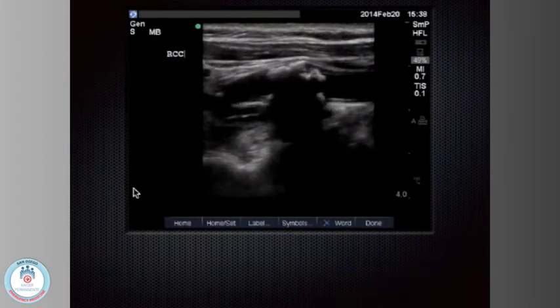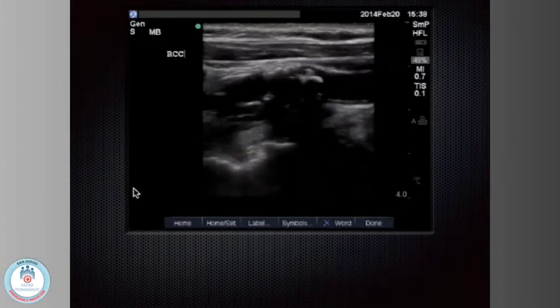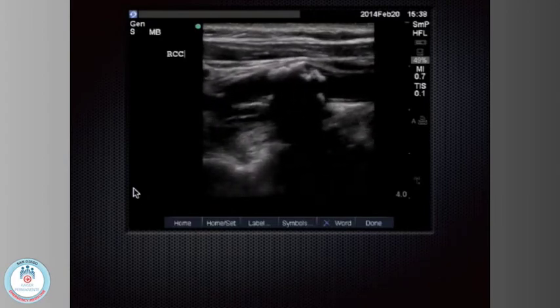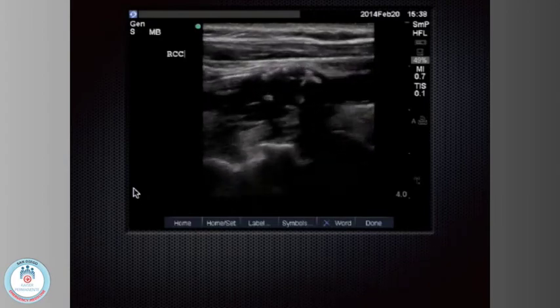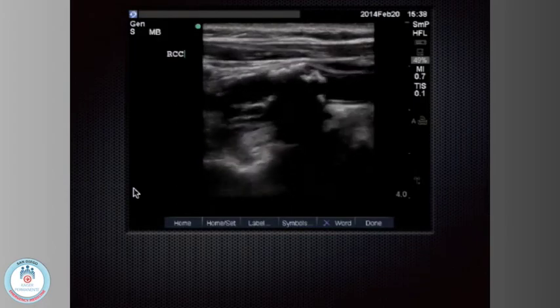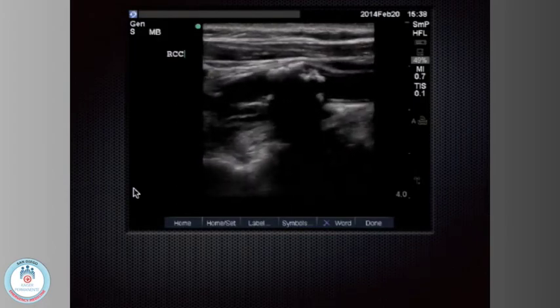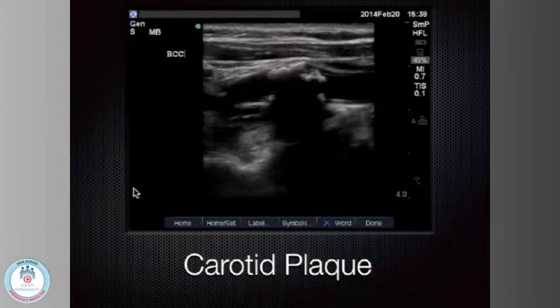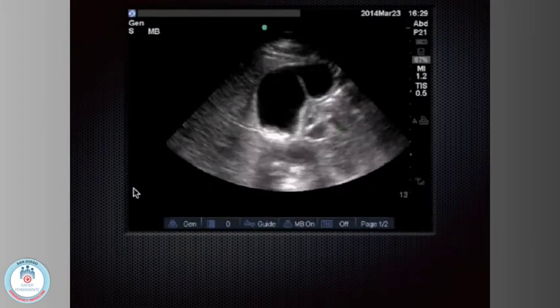Sometimes when they're doing the whole workup and neurology's getting all interested and ordering all their MRIs and this and that, you just show them big old plaques in the right common carotid, and sometimes it obviates what's going on. Just sort of an interesting finding. How about this?